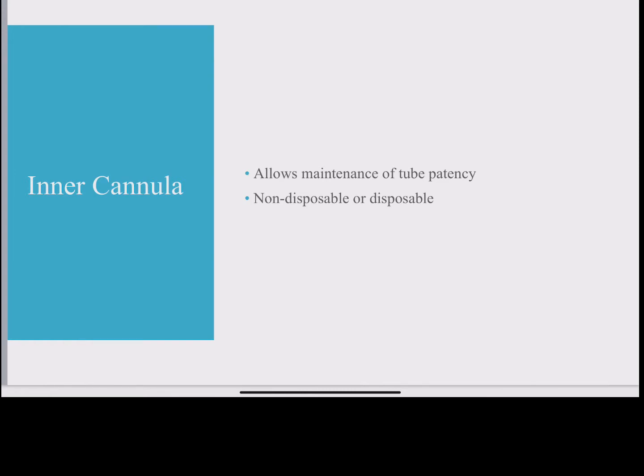For home purposes, we usually use the Shiley. It's the most common inner cannula that we use in the home setting or the hospital setting, specifically at Pioneers.